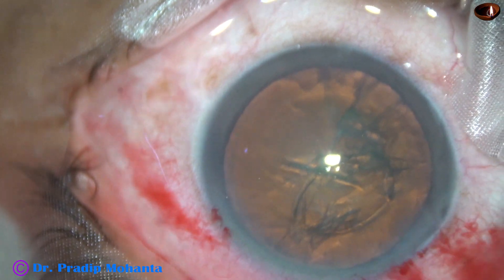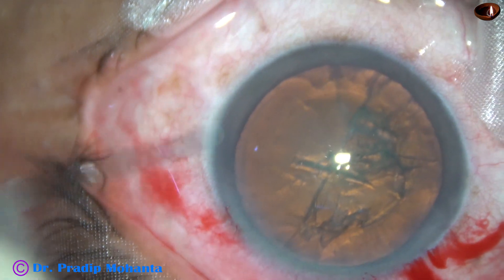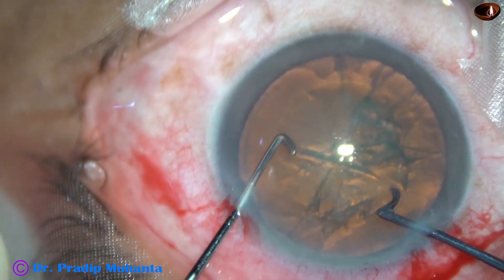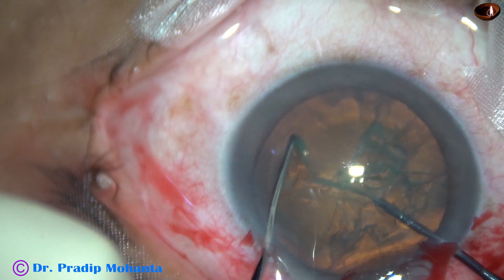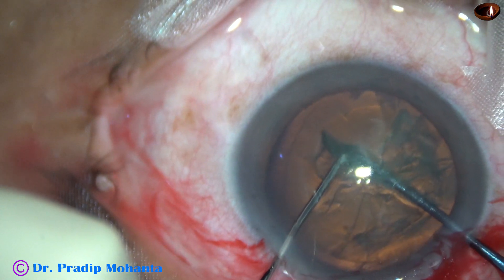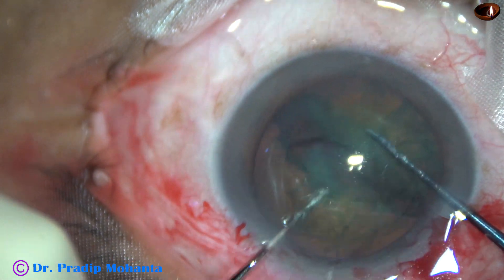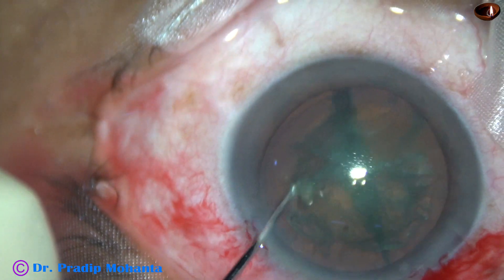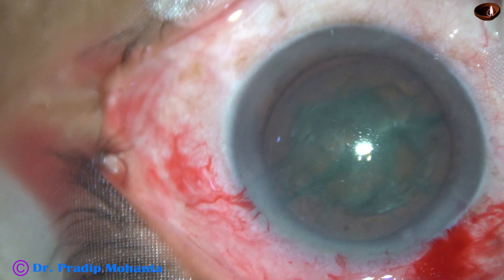Some more visco is added. Now is the time to introduce the FACO probe into the anterior chamber. But before that, this is pre-chopping of the lens mass. This pre-chopper has been designed by Dr. Sohail Irfan Khan from Nandid, Maharashtra. I am using this instrument for soft cataracts nowadays — no financial interest — but I find this instrument very useful, particularly for soft cataracts.